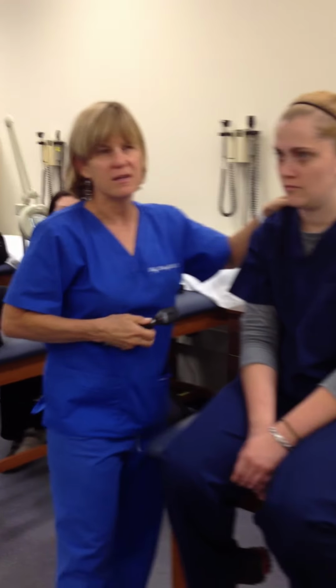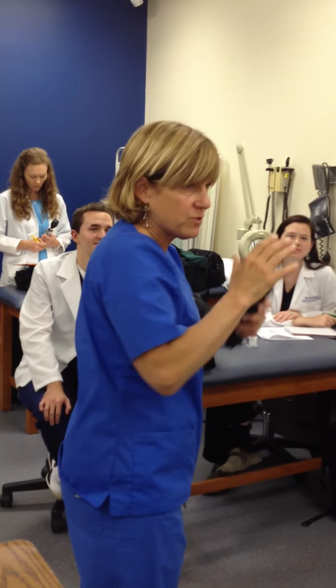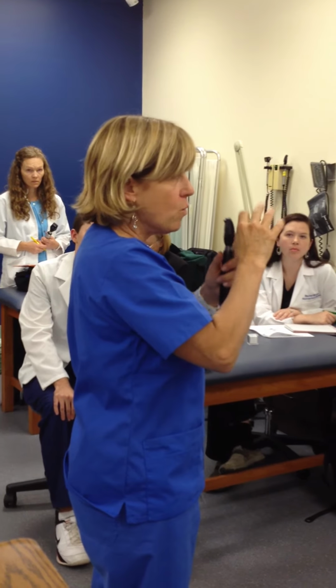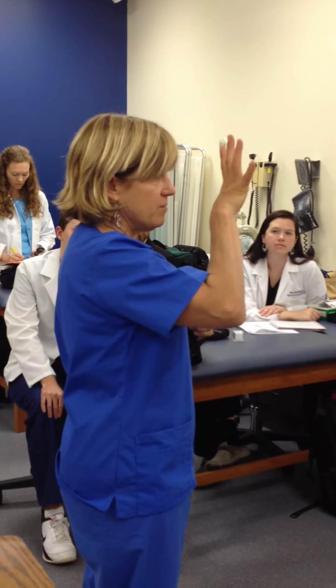And I looked at the macula. Oh, beautiful fundus there, really nice. So you're gonna wanna get all those quadrants with these little guys, okay? You're not gonna see a very wide view of the back of the eye.